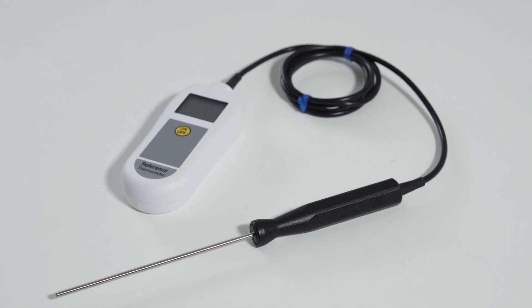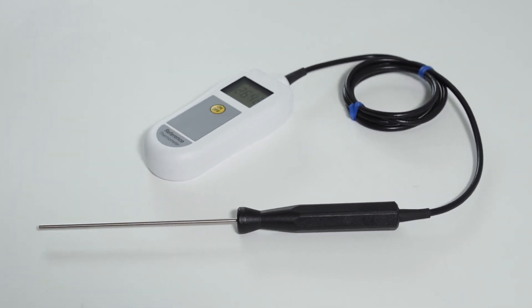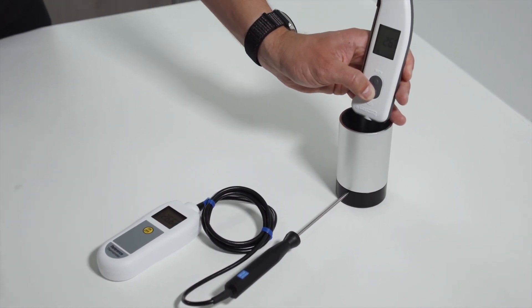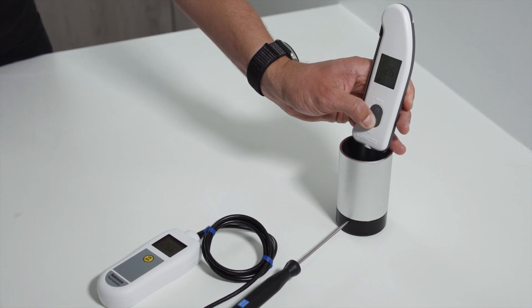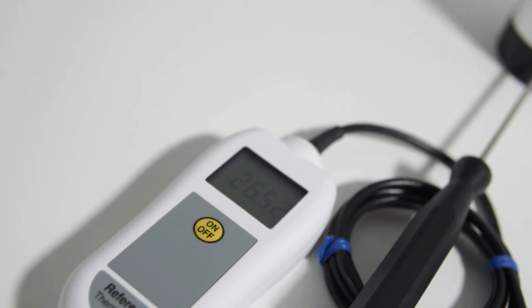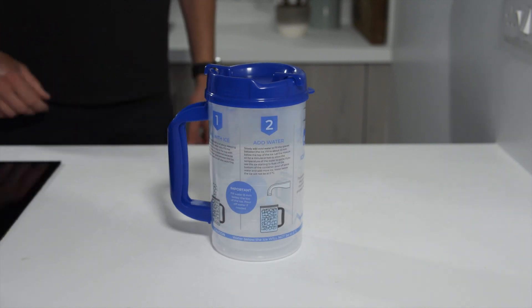Most calibration processes require comparing the readings between the thermometer under test with a reference thermometer. This is a thermometer that you know to be accurate, so it allows you to confirm the true temperature of the source being used for the test. Using a high accuracy reference thermometer, specifically designed for calibration, makes your calibration checks more accurate, particularly if you're using a less reliable method such as an ice bath.